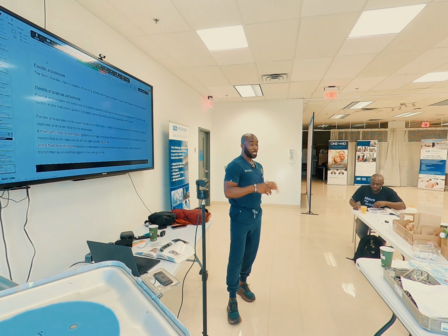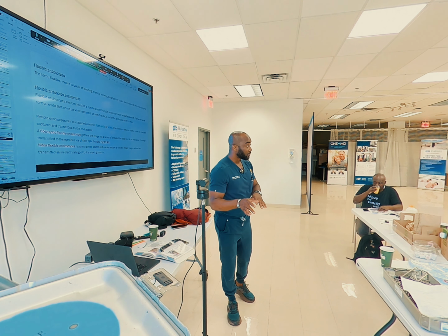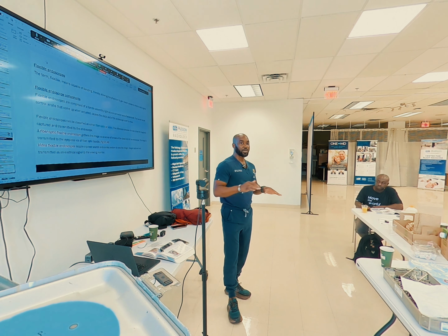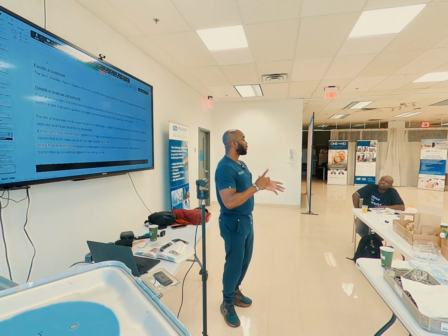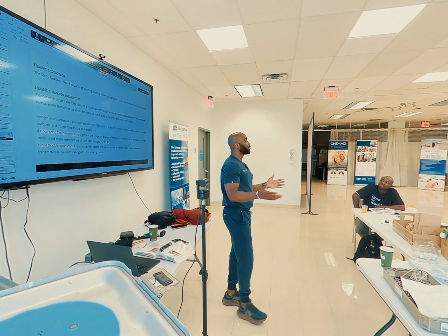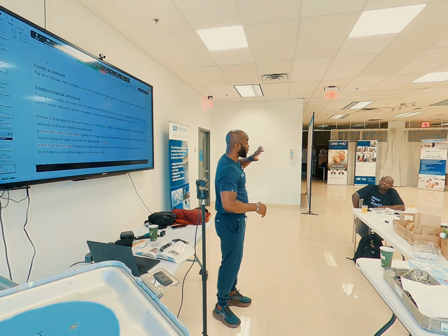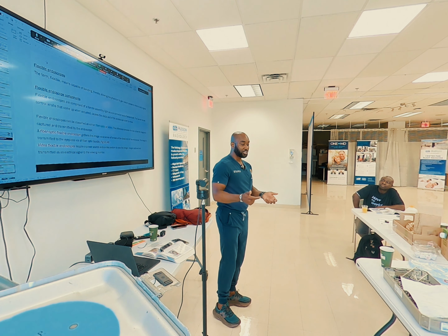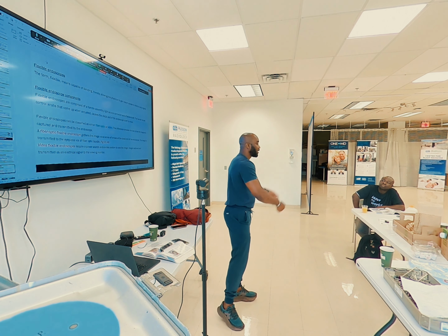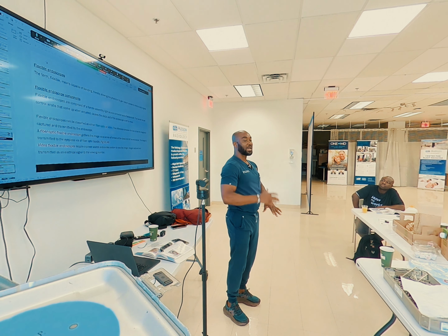Anywhere you work nowadays, if someone brings down a GI scope, it should be high-level disinfected using an AER. Any semi-critical device in the United States of America should be processed using an automated endoscopic reprocessor. If we don't have it, then we can do manual, because they are moving away from manual processes of high-level disinfection of scopes. When we have a GI scope, it should be put into a machine to be processed. We stop washing it, putting it in and timing it with our clock on our hand. No more. SGNA has said, and AAMI has said, that we should not do that.